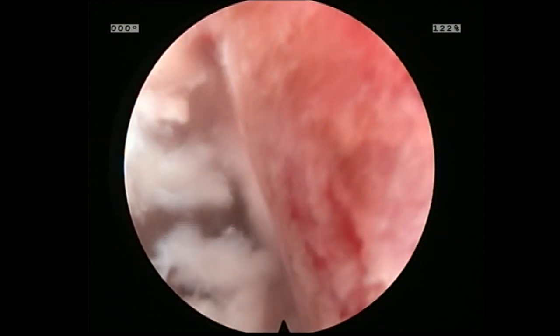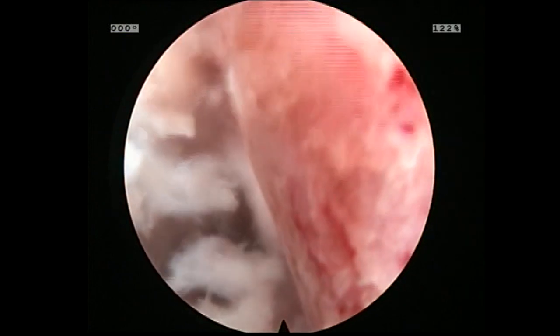Here is the end result with bleeding bone, and here we are ready to deploy the cage.